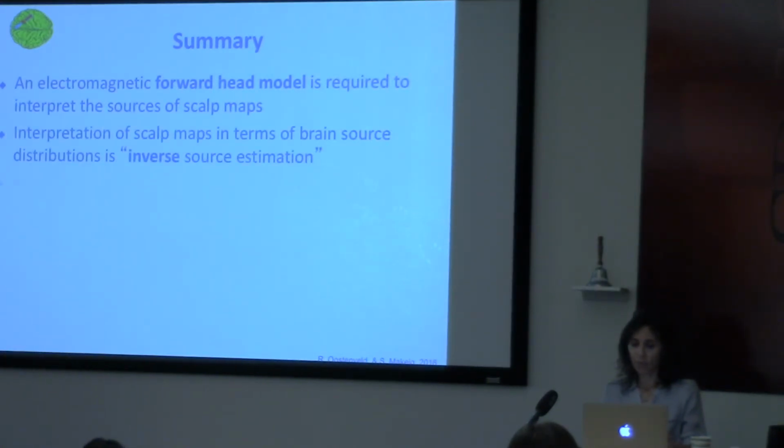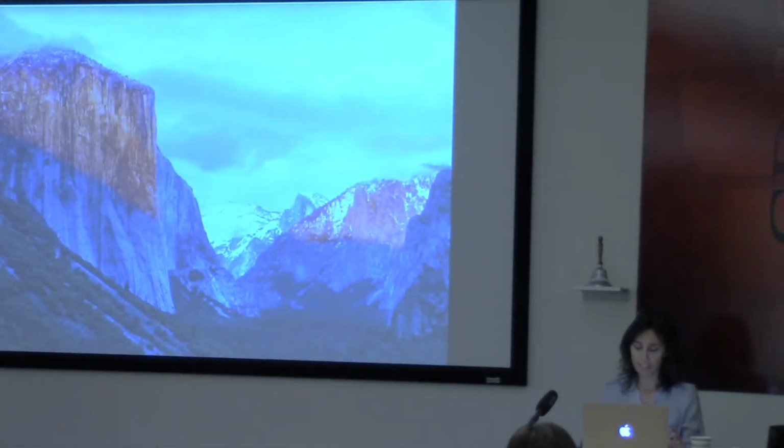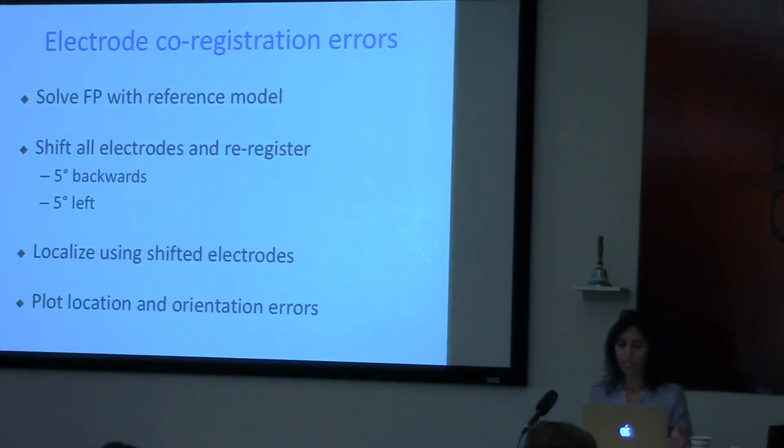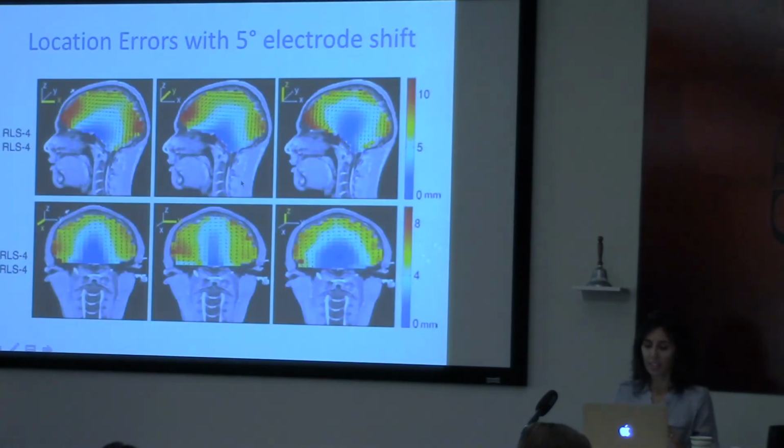And I have more time actually, so I can give more results about these modeling errors. So here is what we did to understand electrode co-registration errors.